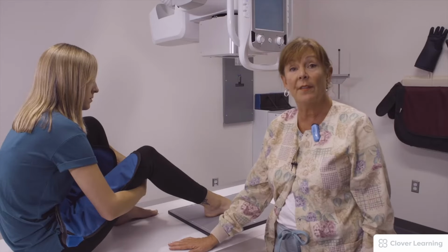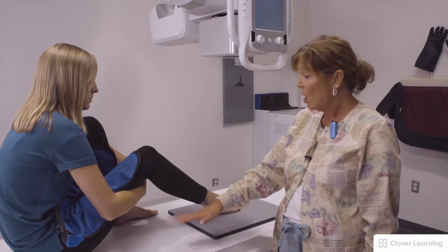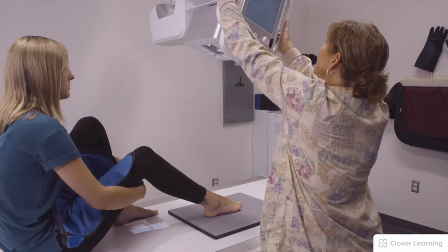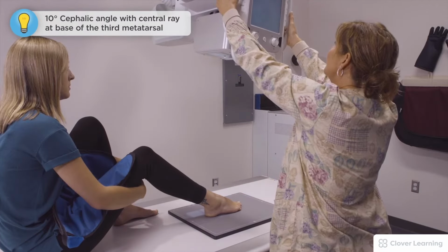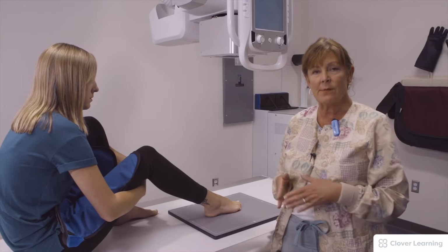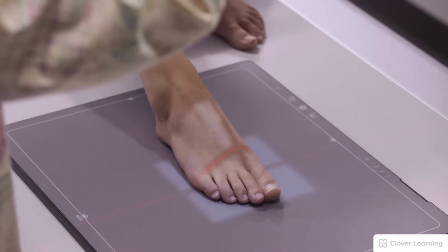So I have my patient on the table. I have the IR on the table. I have shielded my patient. Her foot is placed down the long axis of the IR. So we're adding a 10-degree cephalic angle centered to the third metatarsal. The 10-degree angle is for the purpose of being perpendicular through the metatarsal joint space.